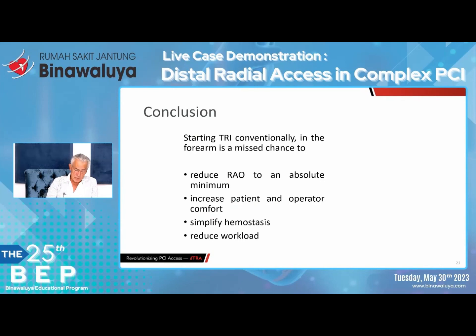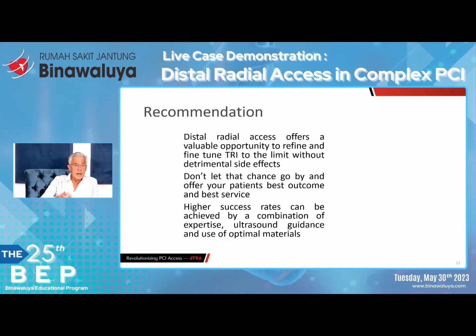So my message is to start a procedure in the snuffbox. This is my recommendation. Distal radial access really offers a valuable opportunity to refine and fine-tune TRI to the limit without detrimental side effects. I think this is a very important message, and don't let that chance go by, because you will offer your patient better service. And I think that the problem of lower success rates is a personal matter.